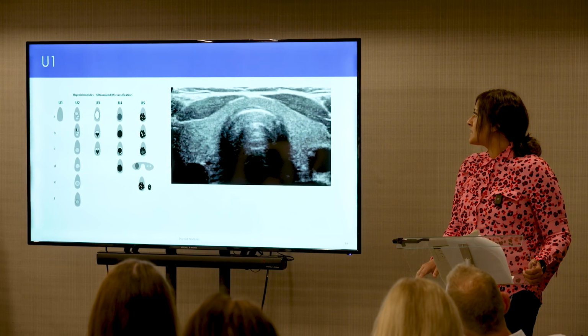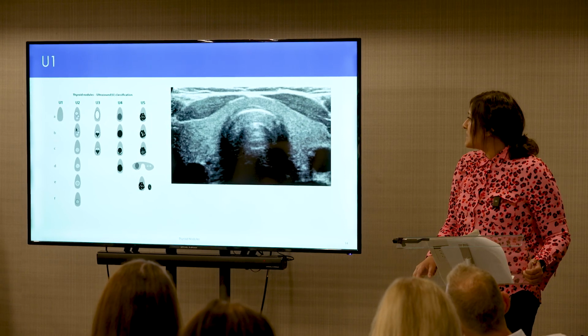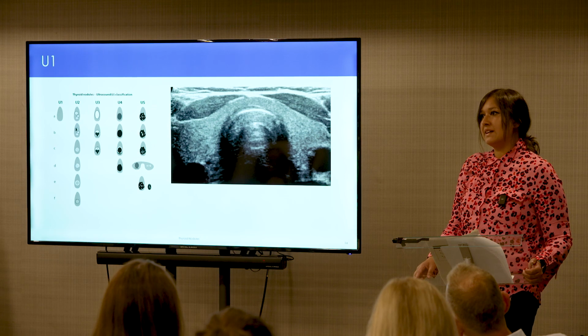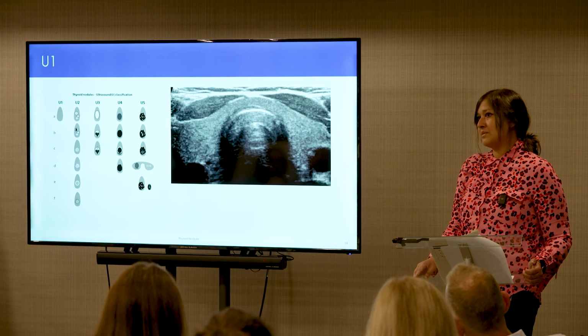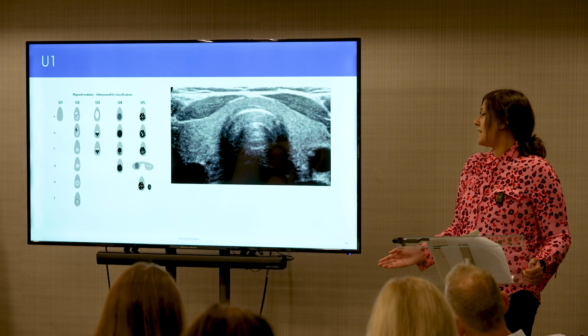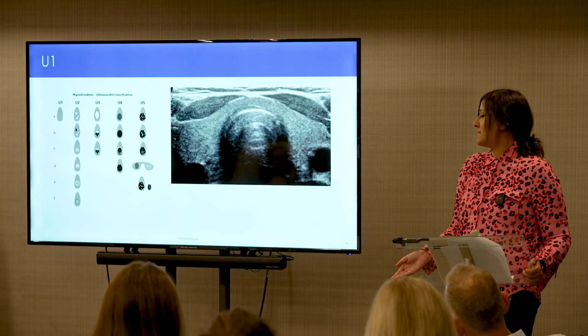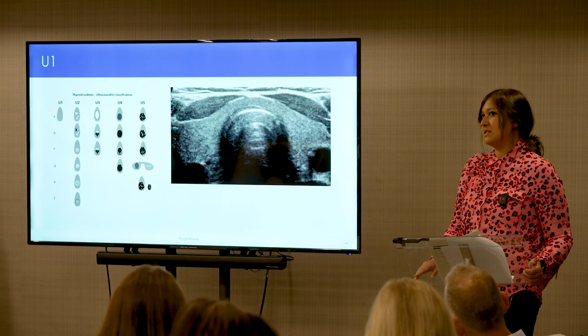So now I'm just going to show you pictures of each grade. So some of these are my own pictures, but some of these I give credit to Steve Colley. He's kind of like the chief thyroid radiologist amongst the head and neck radiologists, and he has some excellent examples which I put into this presentation. So this is U1, and this is just basically a normal thyroid gland, no nodule. Same applies to EU TIRADS 1. It just applies to a normal thyroid gland, basically.